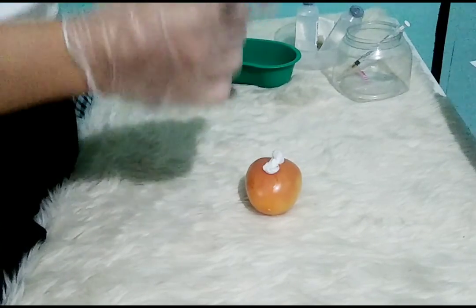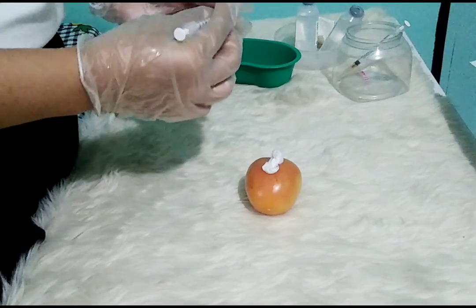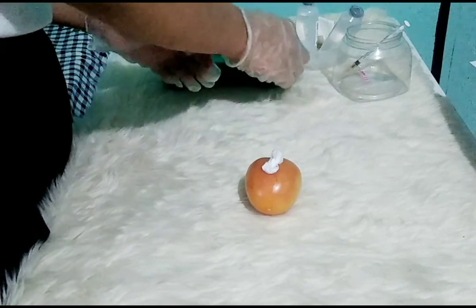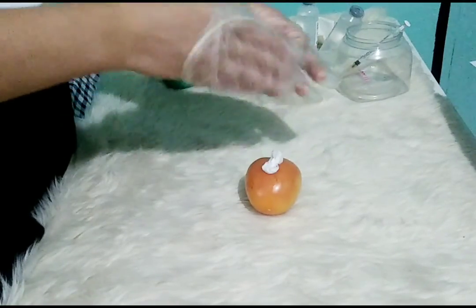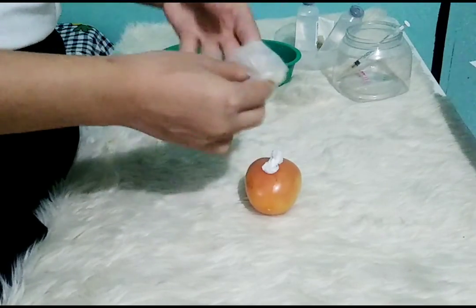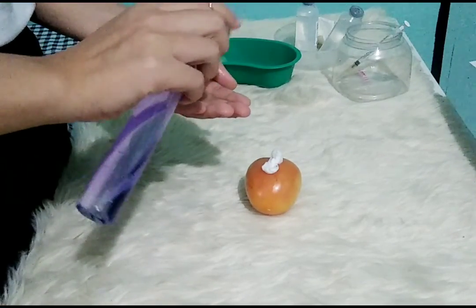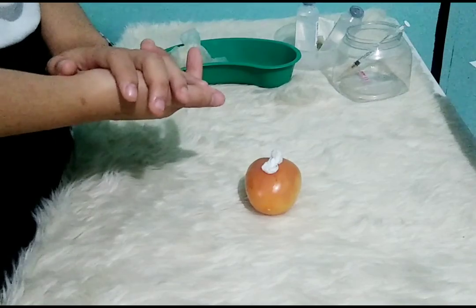Activate the safety device or discard the uncapped needle and attached syringe in a proper receptacle. And then remove and dispose of the gloves. And lastly, perform hand hygiene. Assess the effectiveness of the medication at the time it was expected to act.